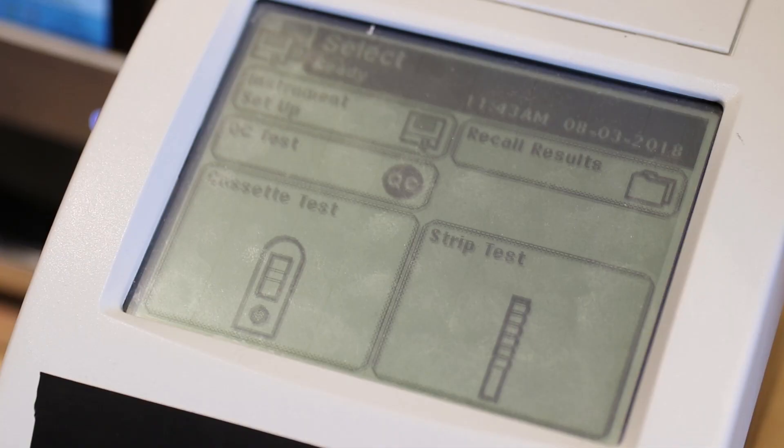This is a urinalysis machine. It looks at urine for various characteristics, like whether there is the presence of an infection or not. These devices will run these different tests and then take the results and send them to the laboratory information system. This is a piece of software that takes the results from a patient's test, reconciles them with the order — what the doctor wanted — combines them, and sends them to the doctor for review.